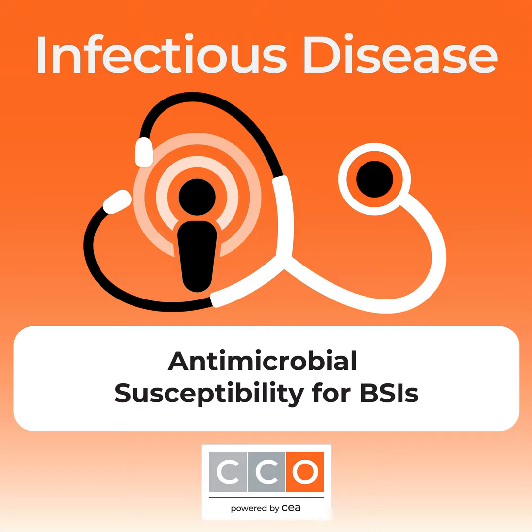So from the perspective of the implementation that we are in the process of right now, the detection of a gene based on the BCID is enough for us to escalate, since we know the profile of those particular resistance mechanisms. Do we need a fast AST in this case? In our facility, no, in the case of Enterobacterales, but we need it in the case of the non-fermenters.